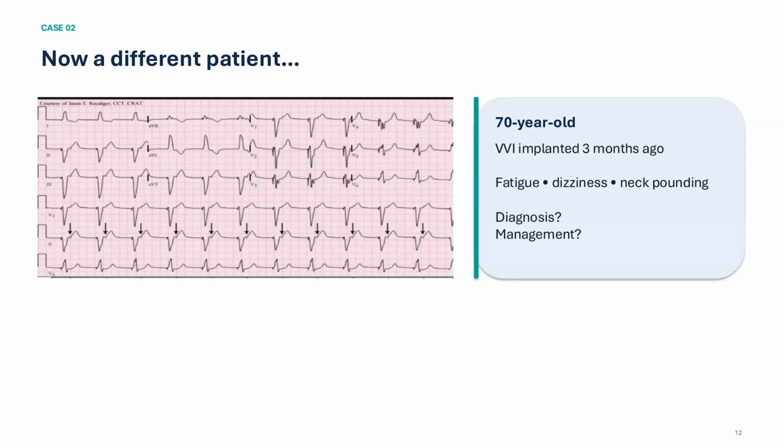One more question, Dr. Mossallami. If the patient has AF and the heart rate is more than 100, shall we put the mode VVI without R or keep it VVIR? Yes, it is a very good question. If the patient has AF at 100, what will you expect? Is this paced rhythm or intrinsic rhythm? Paced rhythm at 100: you should adjust the rate response parameter.